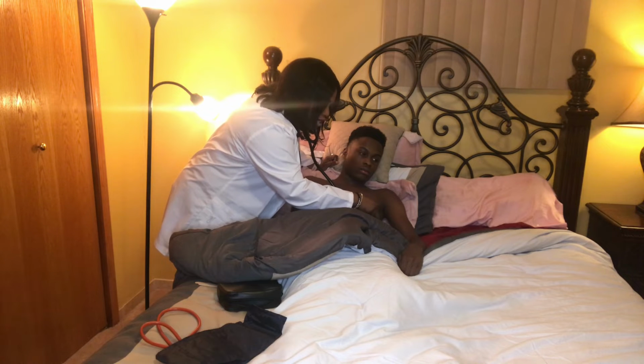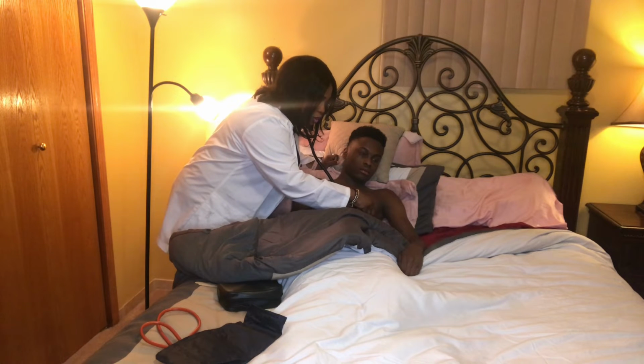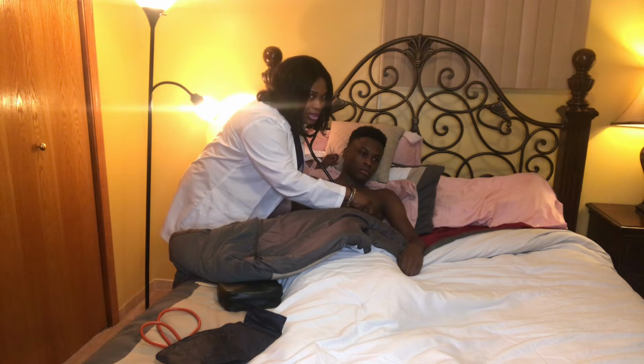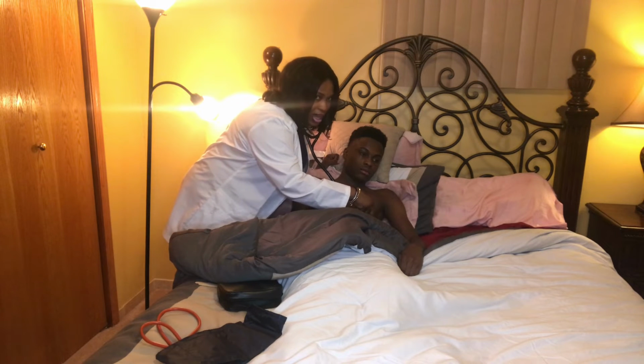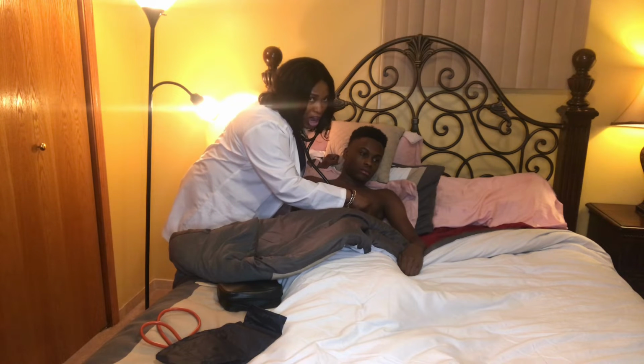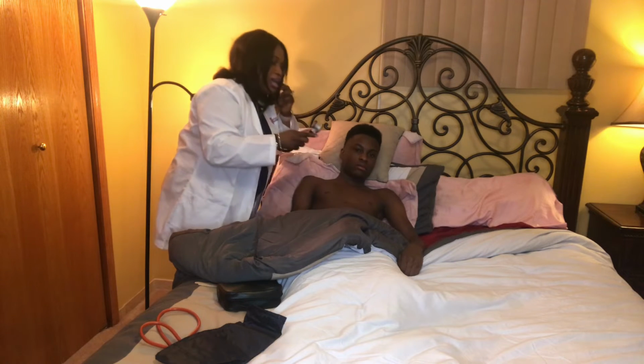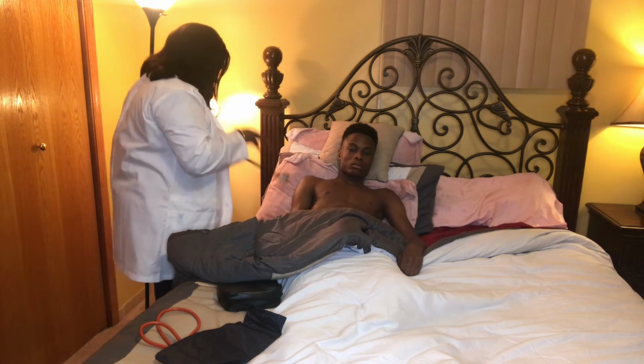And when I move it down to the mid clavicular line, on the fifth intercostal space, I'm listening to the mitral valve, which is the S1 sound. When I listen at the mitral valve and also the tricuspid valve, I'll be listening to the S1 sound, which are the normal sound, and I can hear everything is normal.